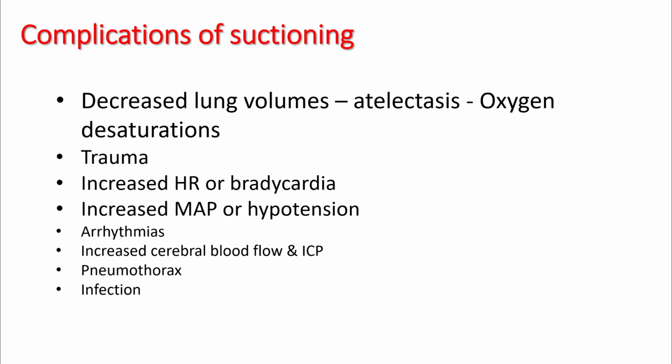Suctioning can reduce the lung volumes and that can result in atelectasis and oxygen desaturation. Suction can result in trauma to airways. Suction can result in transient tachycardia or bradycardia. It can result in transient increase in blood pressure or hypotension. Suctioning can also stimulate arrhythmias, elevate intracranial pressure, occasionally can cause pneumothorax, and increases the risk of infection.